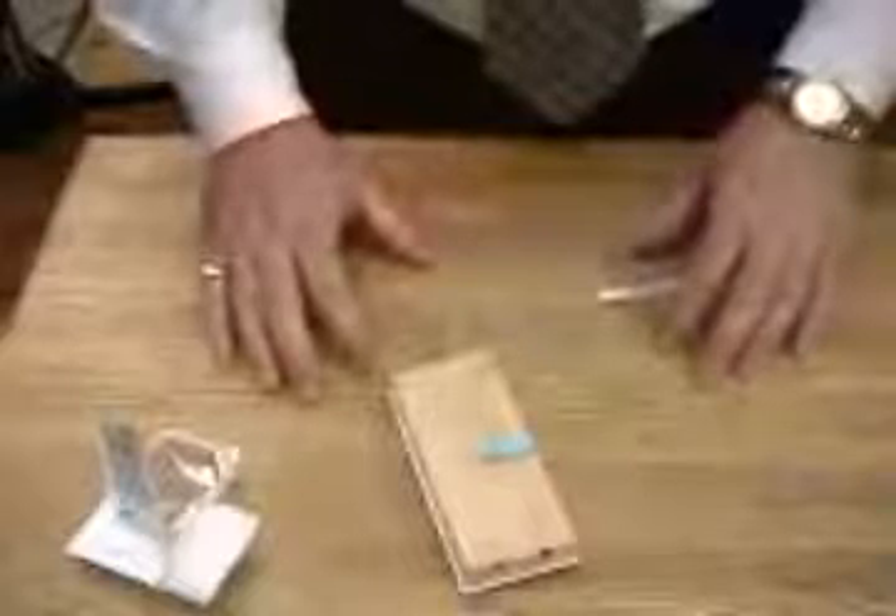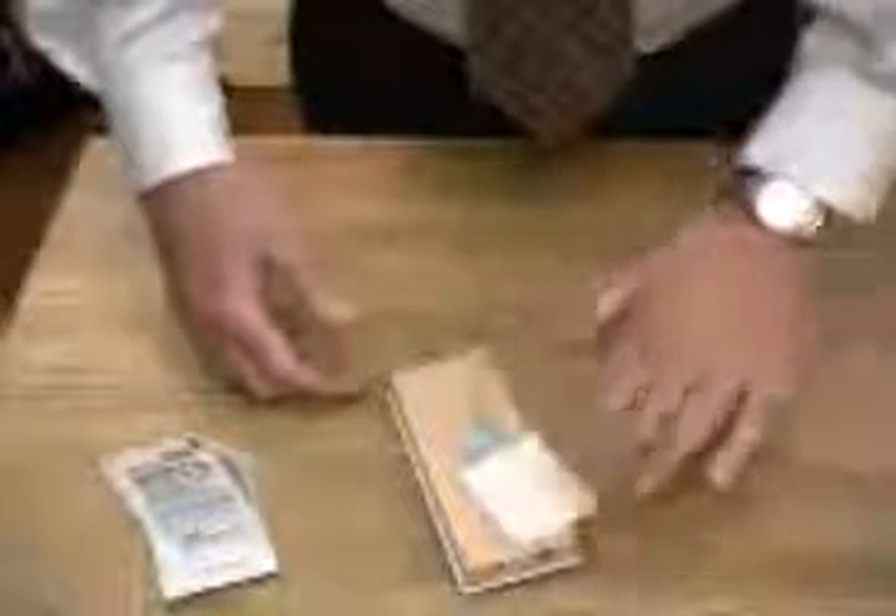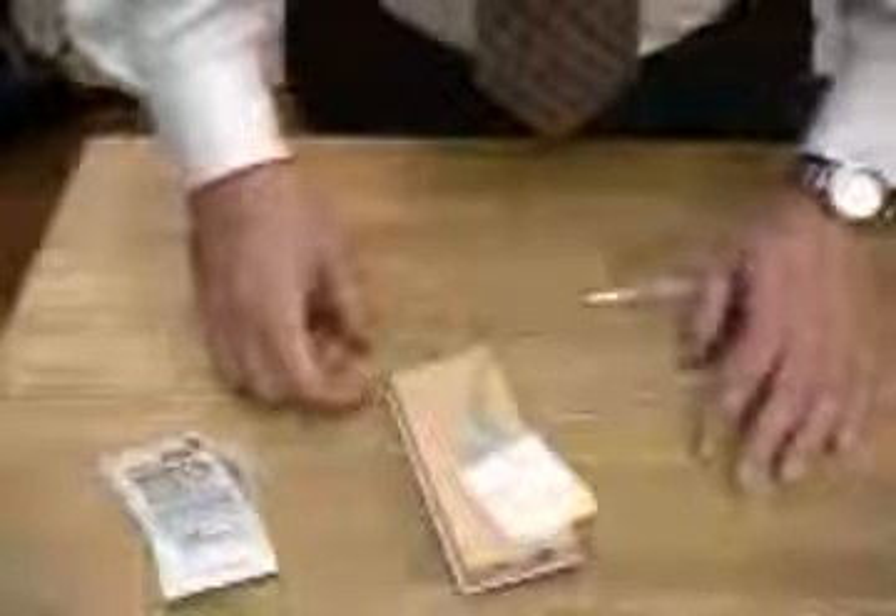the activation of the safety shield. You will need to apply pressure, especially if your patients are on any type of blood thinning medications. To apply pressure, you would use these two fingers, not your thumb. When you're using these two fingers, your thumb will be available to assist in the activation of the safety device.